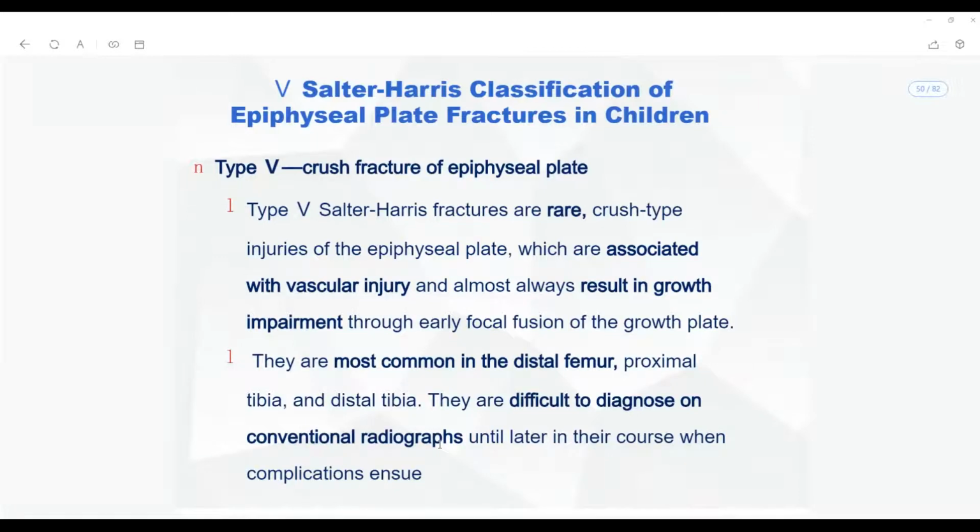because unless and until they are completely ossified, okay, ossification is entirely different from fusion. Okay, fusion is joining together. Ossification is completely forming the tubular bone as a single structure. Okay, so fusion is in the early stages, but a complete joining or the complete ossification is in the later stages. So they are difficult to diagnose on the conventional radiographs.